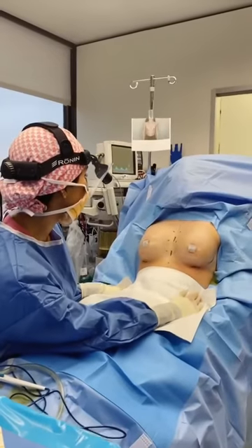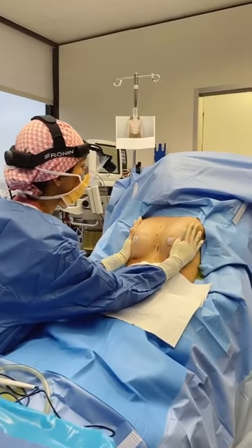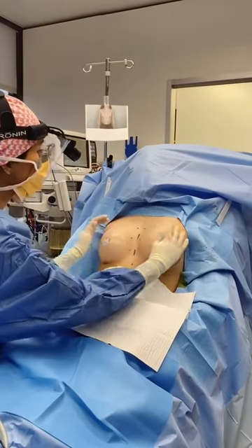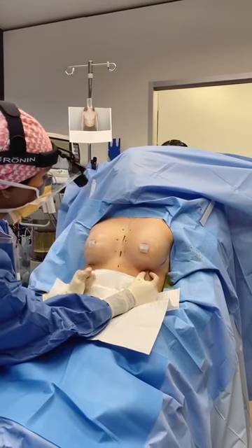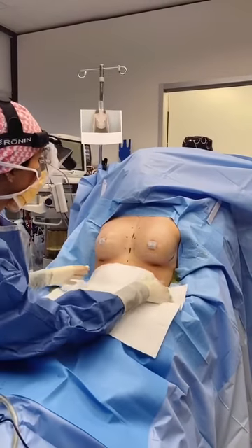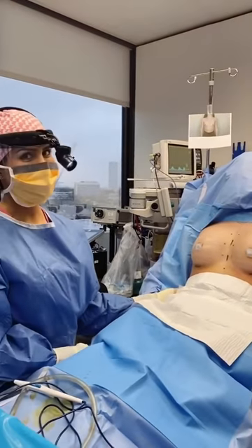She's all finished — 275cc, high profile. You can see she has great cleavage, nice and round. Her incisions are super small, right in her fold. She did great in surgery, and her results are going to get even better in a month or two.